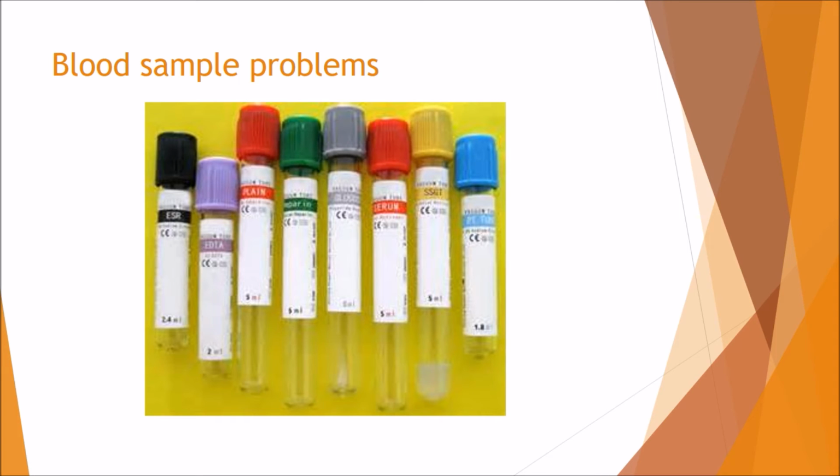And what this is useful, so in your blood you have free-flowing calcium ions, and these are essential for starting the coagulation process. So what EDTA does, it will bind and chelate to these calcium ions and it will prevent these from initiating coagulation. So therefore this is acting as an anticoagulant. And again, each of these tubes contain many different things and they're each used for different things.